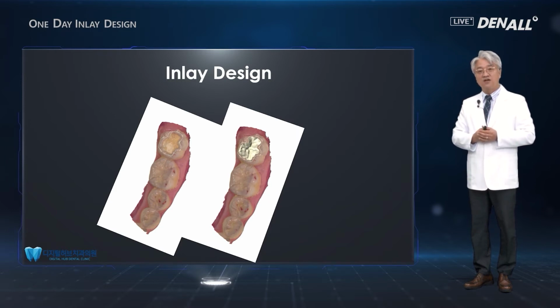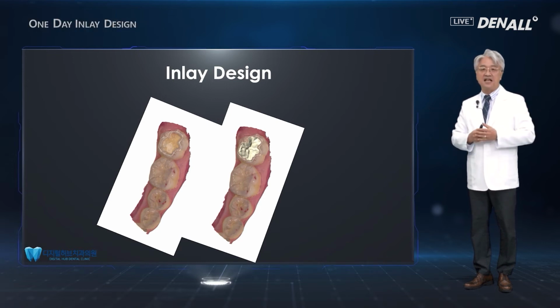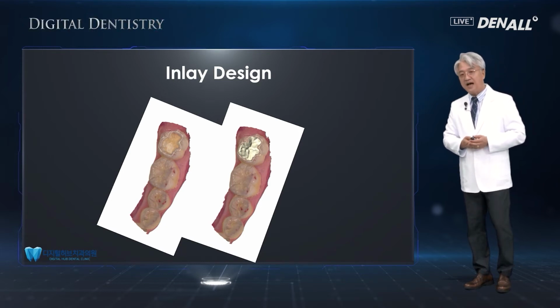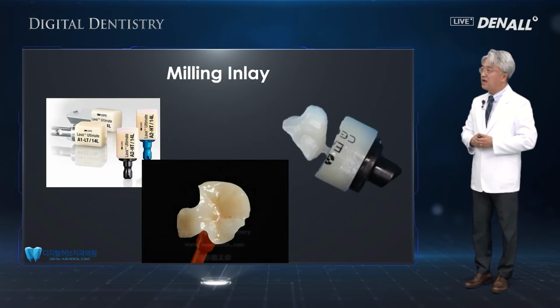But now, with the usage of the 3D printers and 3D printable resins, can now deliver good strength and long-term stability. And now the type of products are now becoming available on the market. So today, milling inlay and printing inlay, these two will be what I'm going to explain to you about one-day inlay design. So with this designed inlay, let's now talk first about the milling inlay.